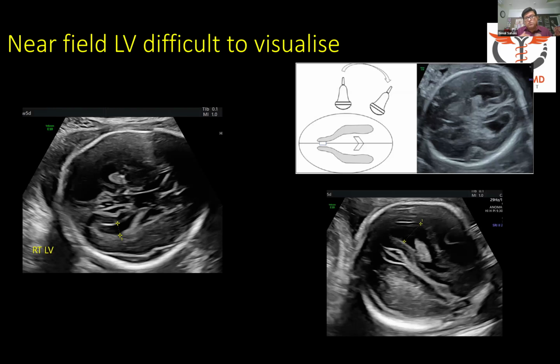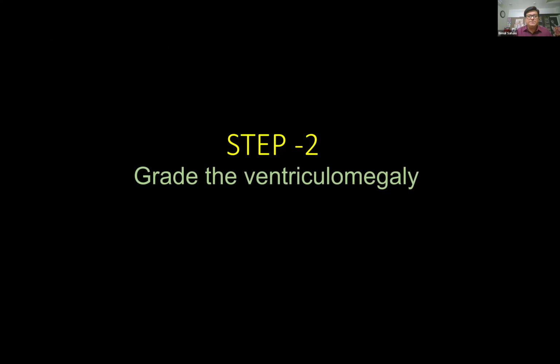Now remember, out of 30 years of experience, I would like to say, okay, as long as it's within the normal range and appearing similar to the distal one, but if you find that it is just borderline, then always try to wait for the fetus to turn and let this side become the one which is distal, because that is the time when you will actually get the most accurate measurement.